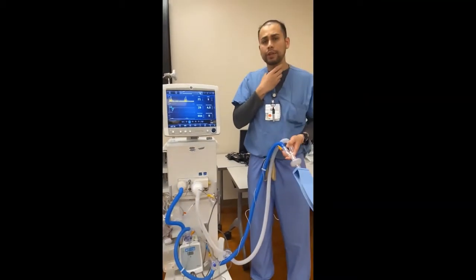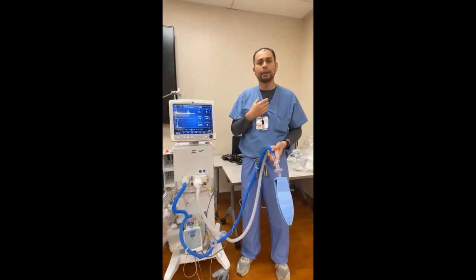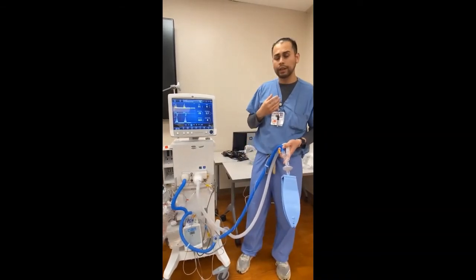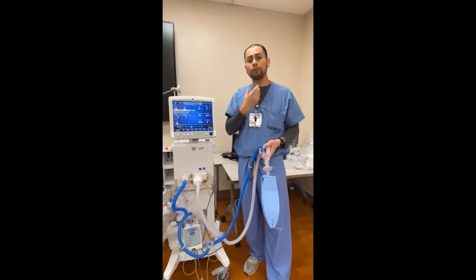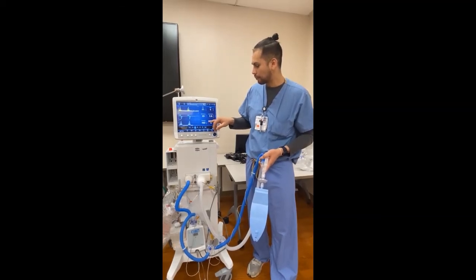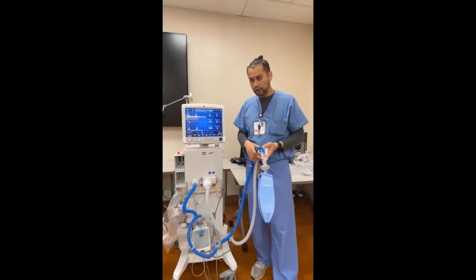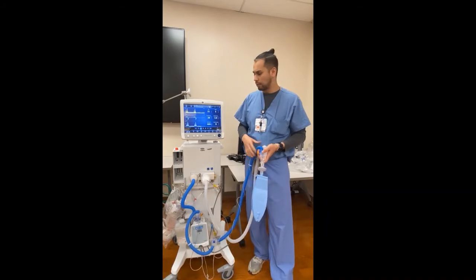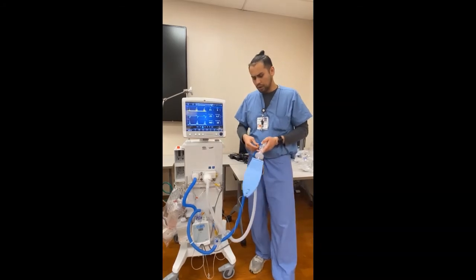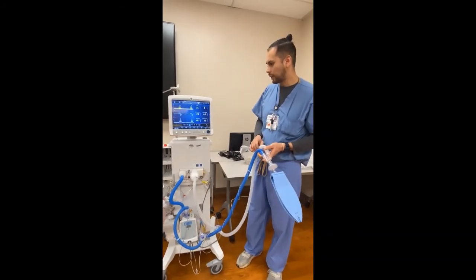Tracheostomy patients tend to have a low tidal volume issue. Due to the cuff pressures in their tracheostomy, having that chronic trach for so long, they're able to be very comfortable with their trach, and eat and swallow while on a ventilator. The cuff pressure may not be fully inflated, and we may not be reaching the tidal volume that is set on the settings here. They may be getting good volumes, they're nice and pink, they're oxygenating well, but their actual volumes read are not meeting what is set here. So just be mindful and let RT know.